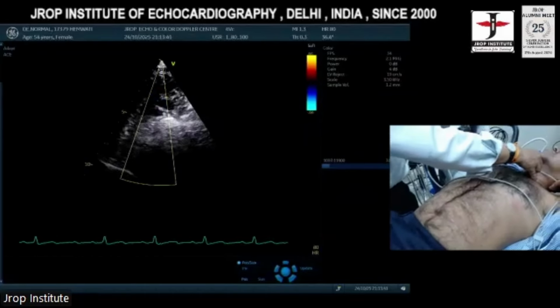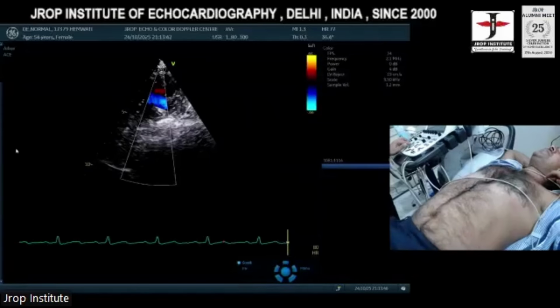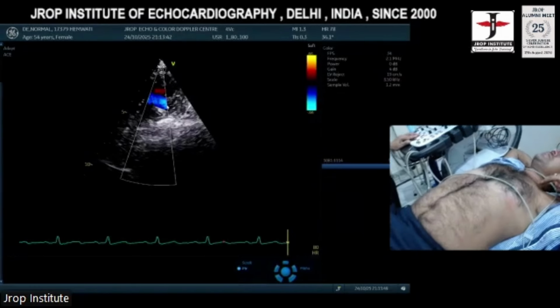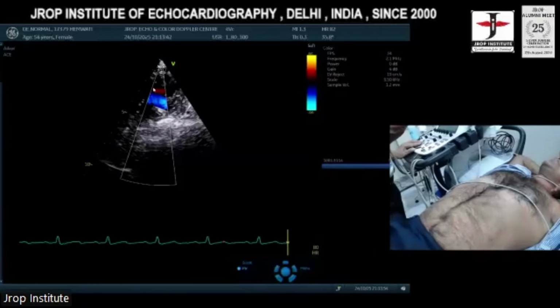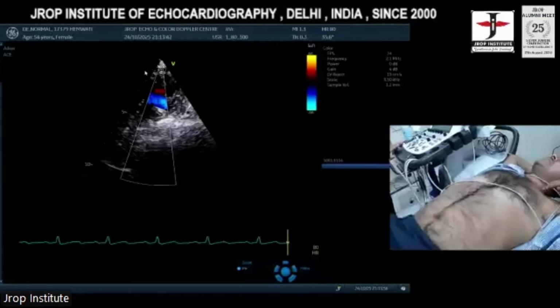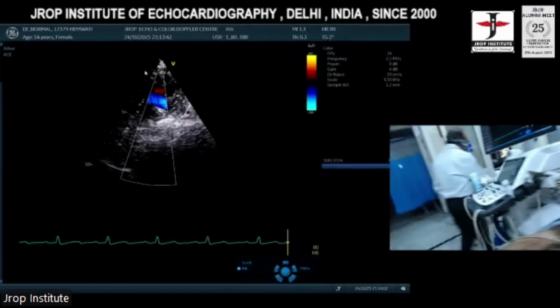And now look carefully. I can see two arteries over here. One is blue, going down. This is the left common carotid. This is the subclavian. Subclavian will go like this. Left common carotid will go like this. Innominate will go like this. All right. Thank you, sir.